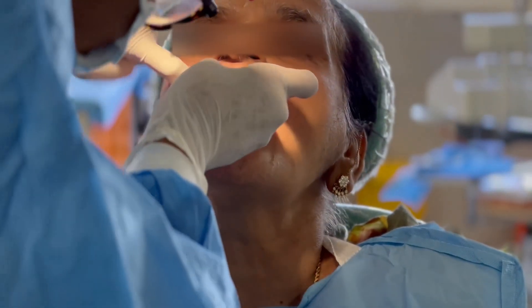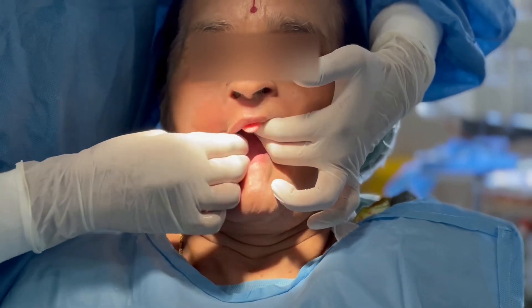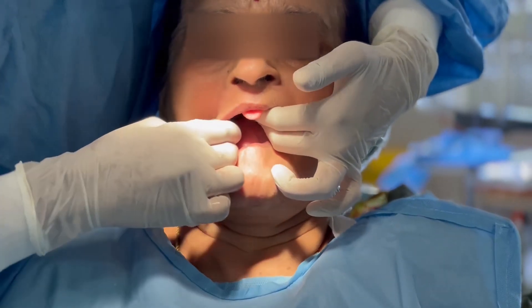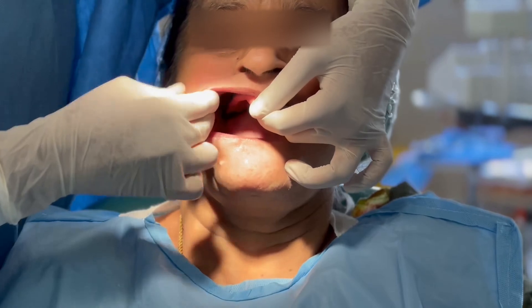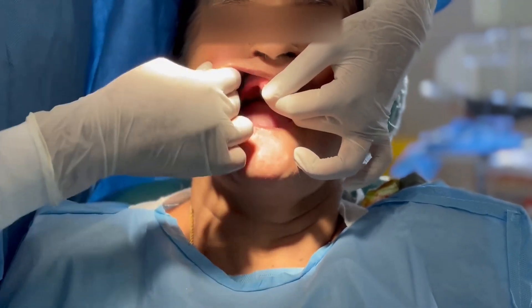This may be performed unilaterally. Passive movements: the cheek is elevated and pulled outward, downward and inward, and moved backward and forward. Active movements: the patient is asked to pucker the lip and smile.